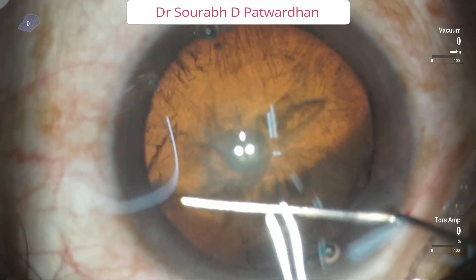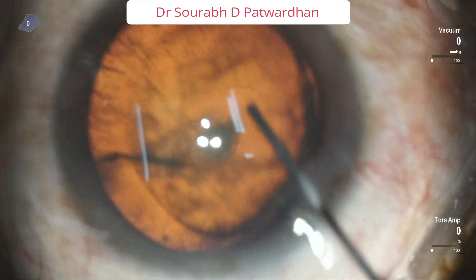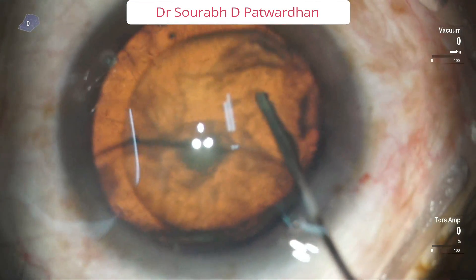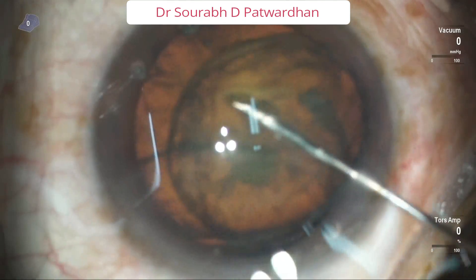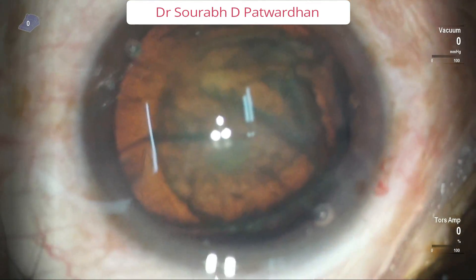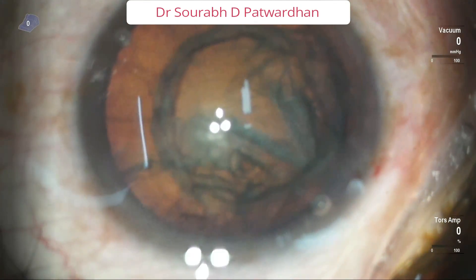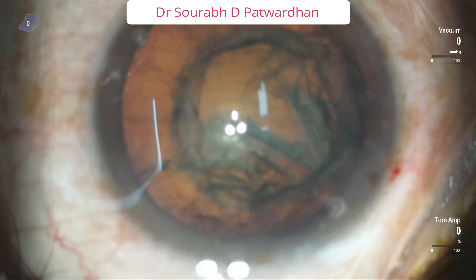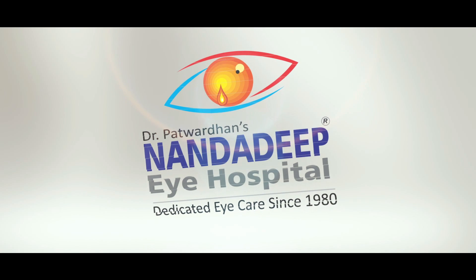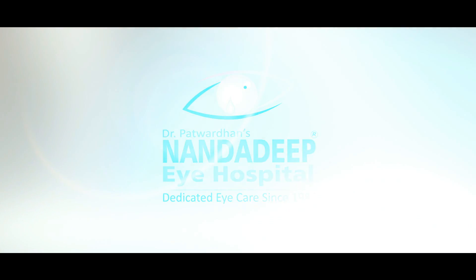It is important to understand when not to do this technique. With a seemingly softer cataract, sometimes on the table you realize when you start doing hydro delineation that it is significantly harder. In such cases, even if you have prolapsed one pole out, just push the visco, gently push the pole back inside the bag, and then go to the divide technique. Thank you so much for watching.